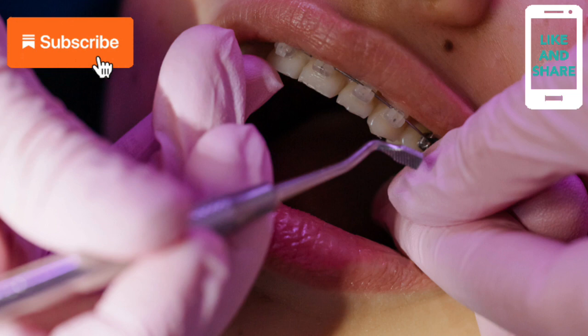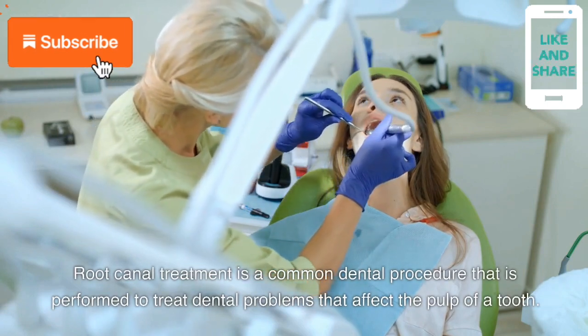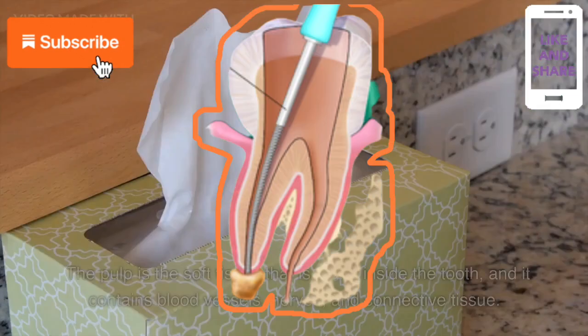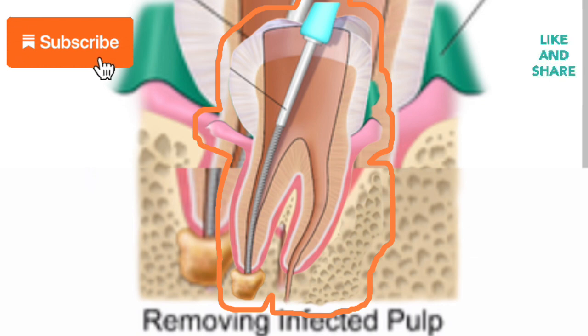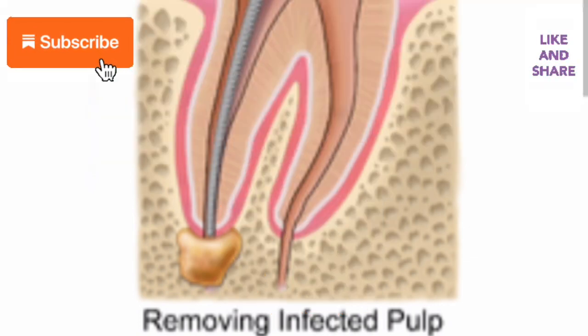Complete guide to root canal treatment, procedure, benefits, and aftercare. Root canal treatment is a common dental procedure that is performed to treat dental problems that affect the pulp of a tooth. The pulp is the soft tissue that is found inside the tooth, and it contains blood vessels, nerves, and connective tissue. When the pulp becomes infected or inflamed, it can cause pain and discomfort, and if left untreated, it can lead to more serious dental problems.